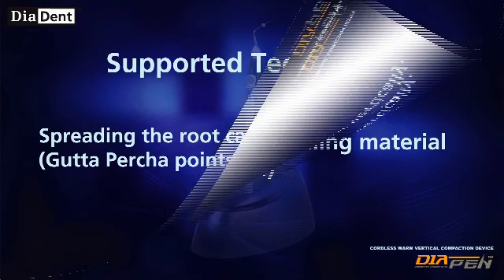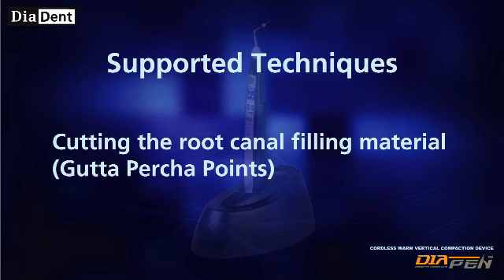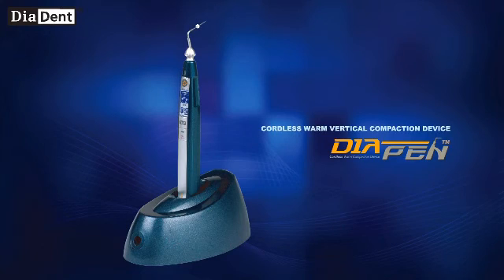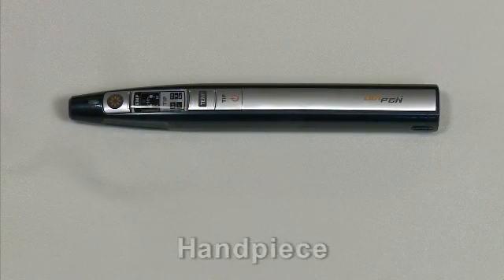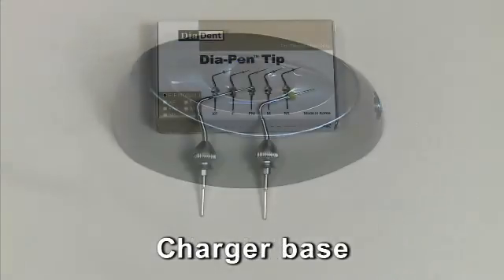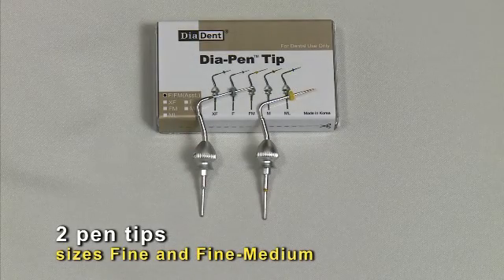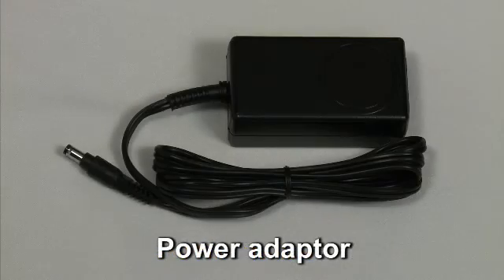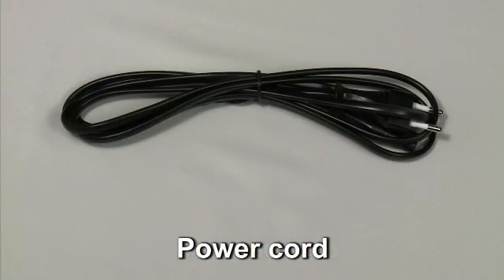Additional techniques include cutting and compacting the root canal filling material using heat. The Diapen kit includes a handpiece, a charger base, two pen tip sizes (fine and fine-medium), two silicone covers, a power adapter, and a power cord.